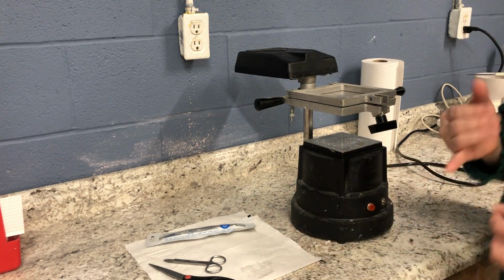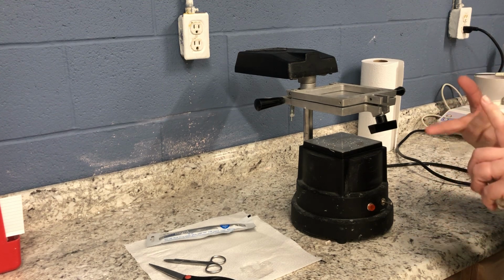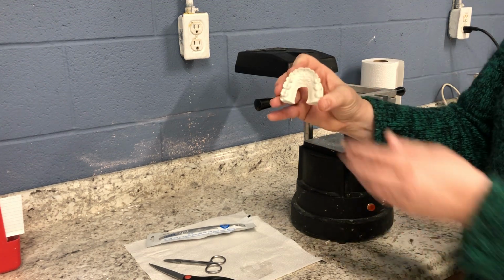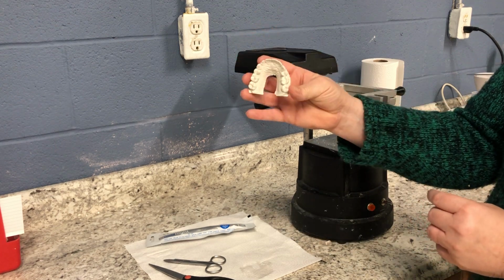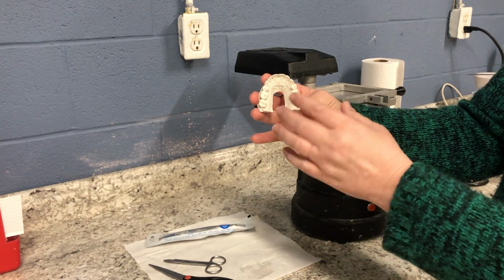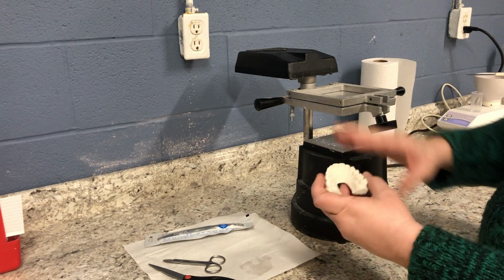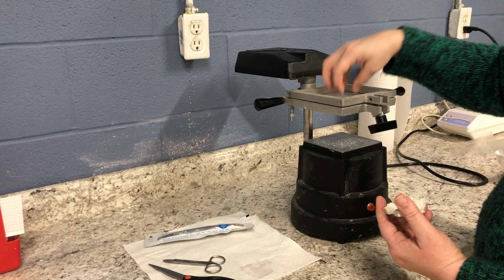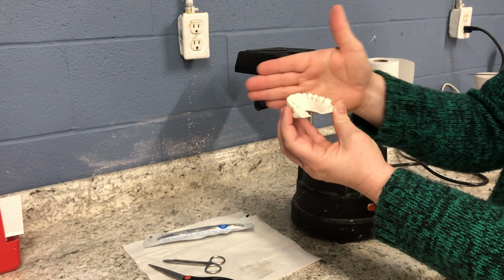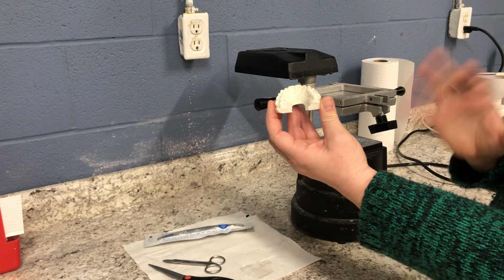So we've already taken the impression, disinfected it, poured it up, trimmed it, and now we're ready to make a bleaching tray. So with this particular model for bleaching, you have to have the inside cut away so that when this is turned on, it's going to suction down, pulling the tray material with it, and you want it to suction on the outside buccal, anterior, facial, lingual.